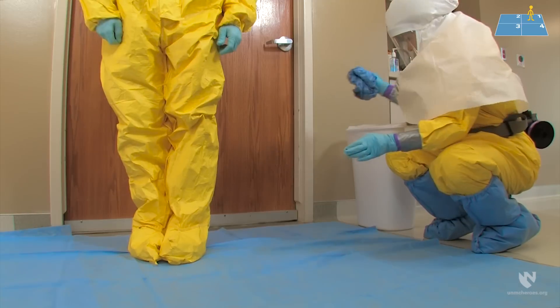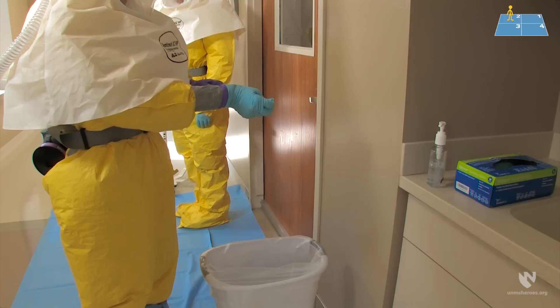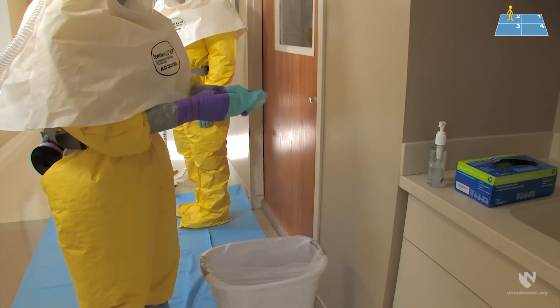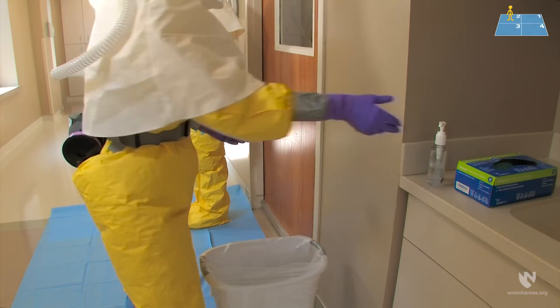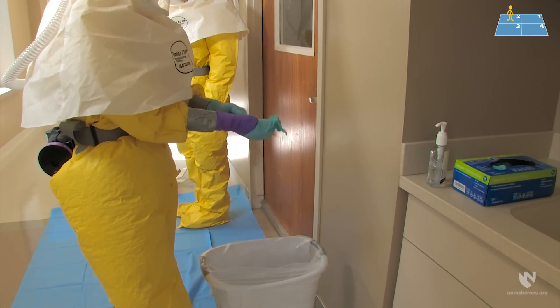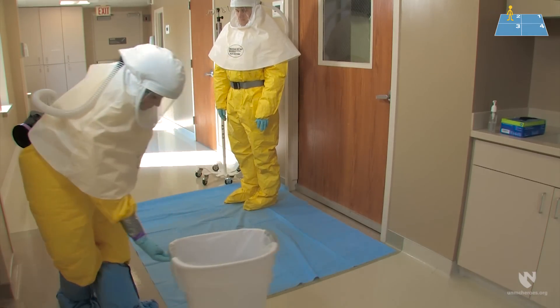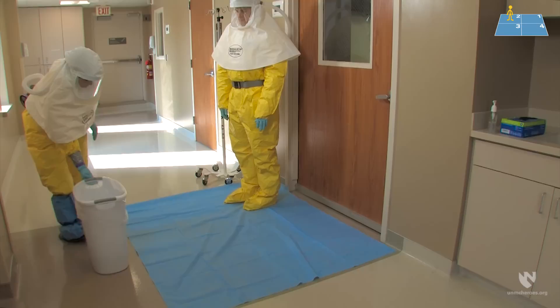The doffing partner will then remove the second boot cover, rolling the dirty side downwards, being very mindful of where the dirty side may come in contact with items around you. Then move the second foot into the second quarter of the doffing pad. Once removed, the second boot cover is placed gently in the trash. Before the next step, the doffing partner must remove their outer patient care gloves, placing them gently in the trash, disinfect the purple long cuff gloves, and re-glove. The doffing partner should carefully move the trash can around the edge of the doffing pad so that it is closer to the new position of the healthcare worker.